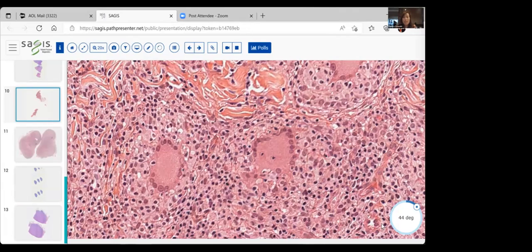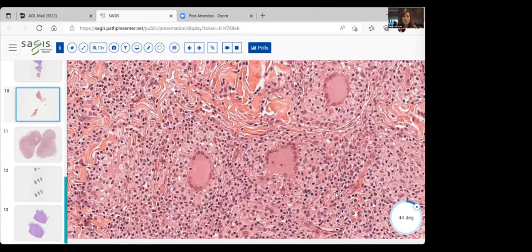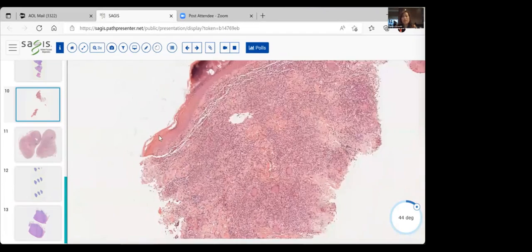And so that is probably why in the clinical appearance you see pendulous structures. They've lost their elastic fibers and now they're just hanging loose, like the back of an arm of an older lady, just loose and floppy. So this is such a rare condition, but I just love it. And there's nothing else that looks quite like that. This is granulomatous slack skin condition. All right, we only have 3 more to go, so hang in there.